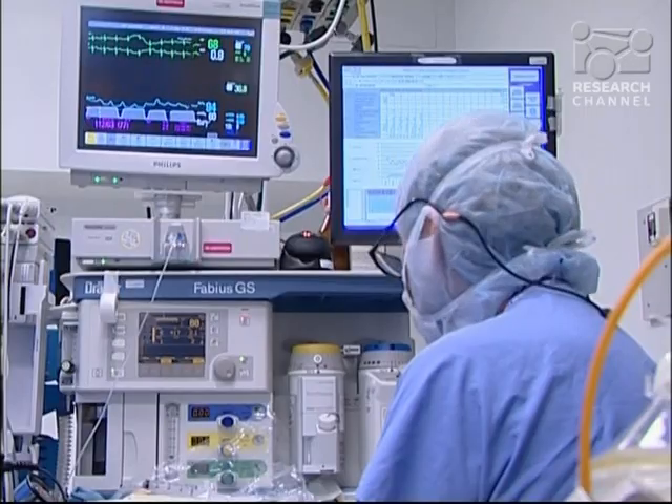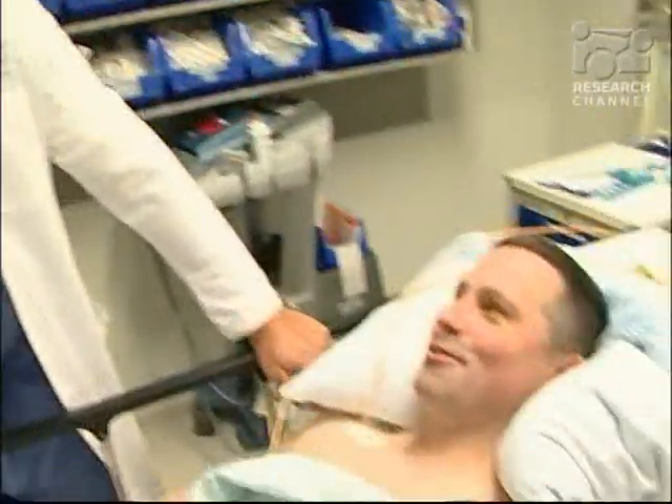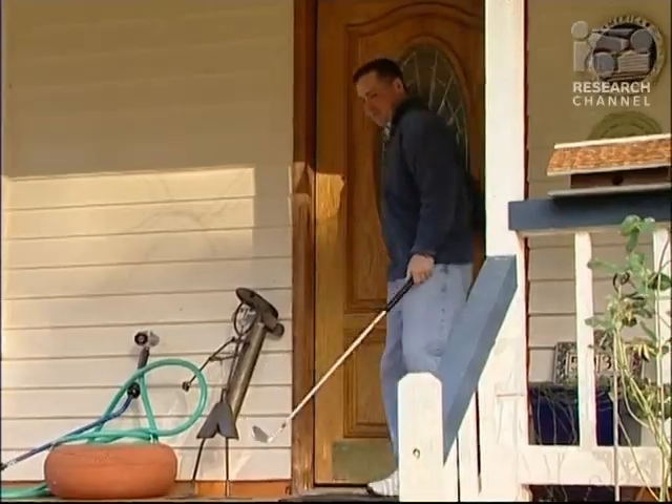Unlike traditional hip replacement, this procedure removes very little bone. It's an option for otherwise healthy patients who are physically active and have good bone density. Bone preservation is a good thing, because every time you go back to do a revision hip replacement you take more bone, and procedures get more complicated. So with this procedure, if you need to go back in and revise it 10 or 20 years down the line, it's fairly straightforward — you take basically the same amount of bone that you would have taken had you done a primary traditional total hip replacement in the first place.